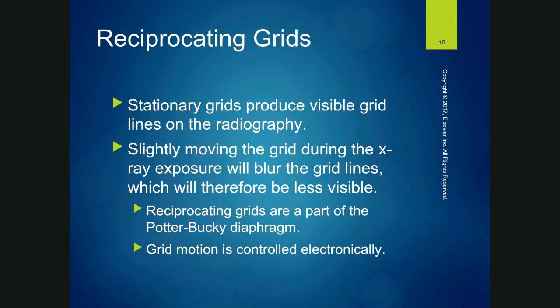reciprocating grid. Whenever you guys are doing things in the Bucky, you are using grids, whether you realize it or not. They're just built in and they shake during the exposure.